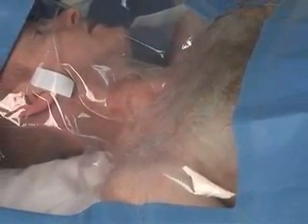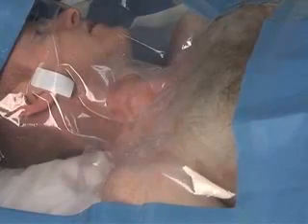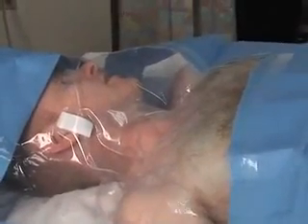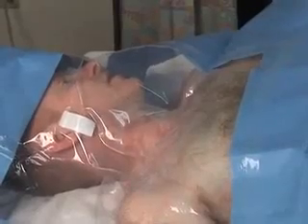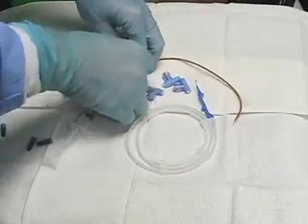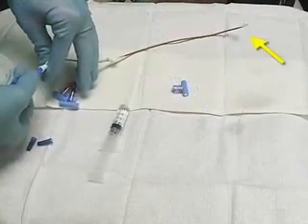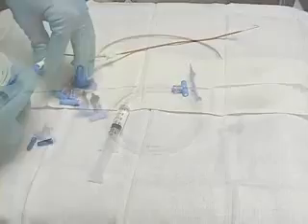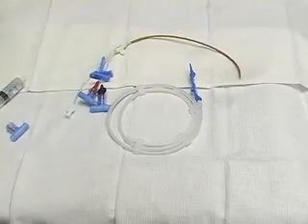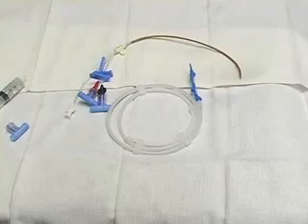If the patient is conscious, explain that his or her face will be covered, but that breathing will not be obstructed, and that he or she can signal for attention by raising his or her hand. Flush the lumens of the central line with saline or heparin, and ensure that the guide wire threads easily through your needle. Remove the cap from the port through which the guide wire will be threaded. This is commonly the longer lumen.